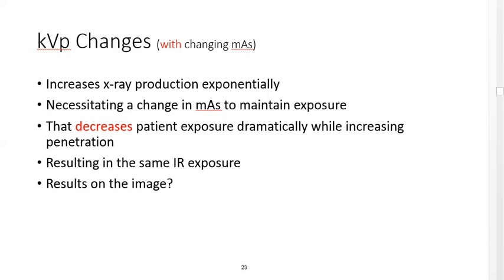See if you can see any real difference in contrast or density. Do it without changing mAs, do it with changing mAs, and see if you can see any real difference. And then do the exact opposite. Shoot one at 60 kVp, and then drop your kVp back to maybe 50 and see if you can see any difference. Then compare the 50 and the 70 and see if you can see any difference. It's pretty remarkable what the computer algorithm does for contrast and density.